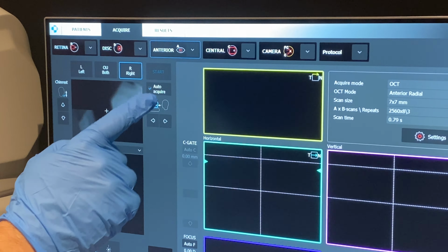And staying on output for a second, if you had a hospital and they particularly said it's got to be a DICOM compatible file, you just choose one of these because these are all DICOM compatible files. Whether it be a single PDF, a single JPEG, or the tomogram series.